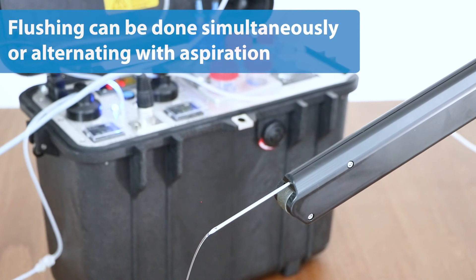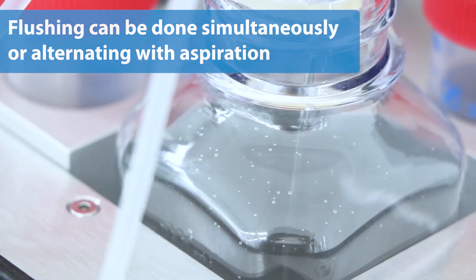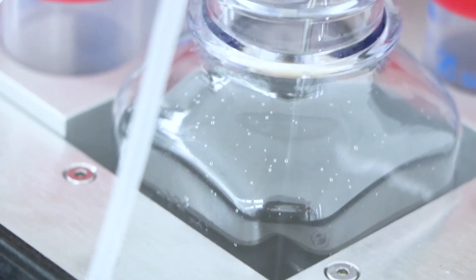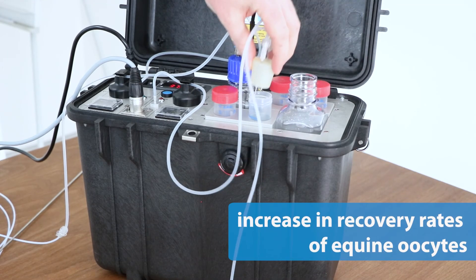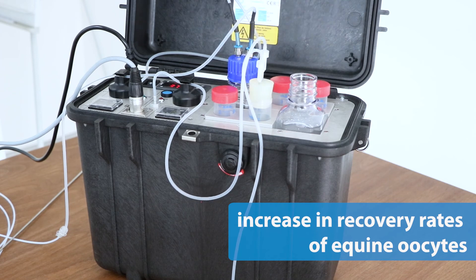Flushing can be done simultaneously or alternating with aspiration. The procedure of repeated flushing of follicles results in a substantial increase in the recovery rates of equine oocytes.